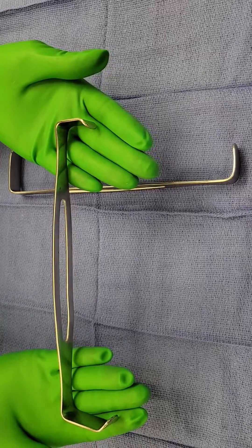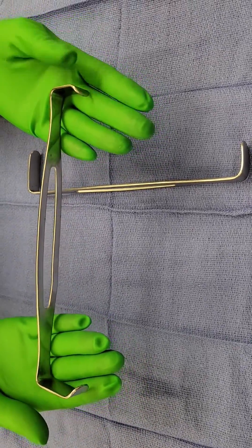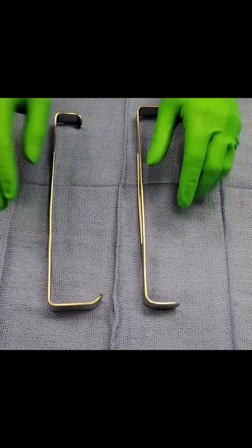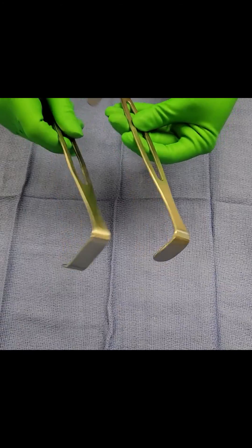It's always a joke which side is the Army side and which side is the Navy side. But to be perfectly honest, there is no Army or Navy side. The Army-Navy retractor got its name from being used in the military, and it was commonly used in the military because it's such a strong, sturdy retractor.